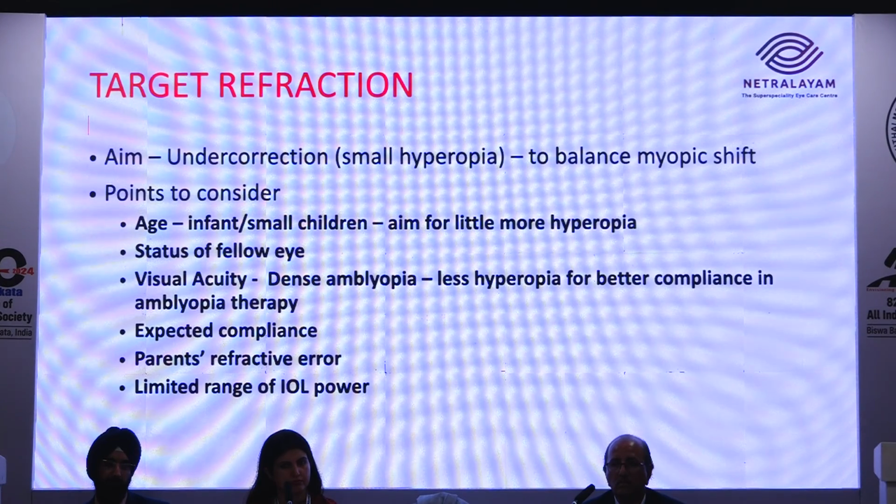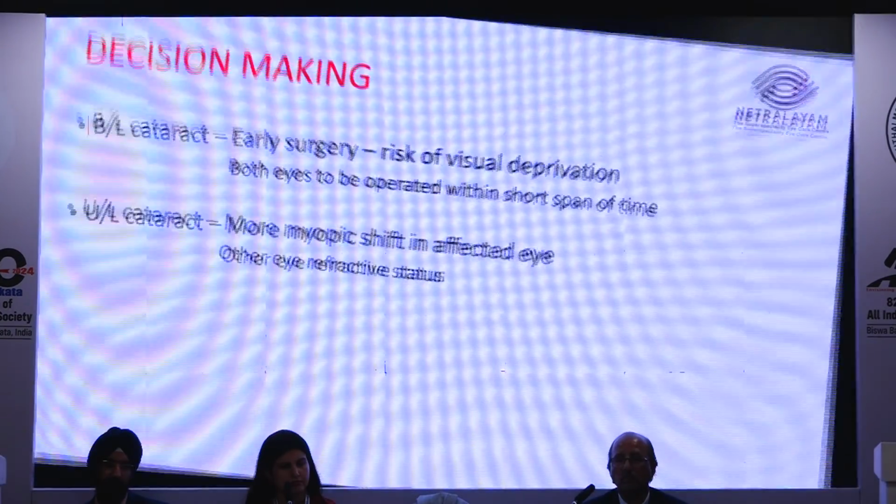And limited range of IOL power. This is another important factor. Some children, if you do biometry, you will get IOL power of maybe 33, 34, 35 diopters, and the power which is generally freely available is up to 30 diopters. So that decision has to be taken. What do we do? I think sir will give some idea on that.